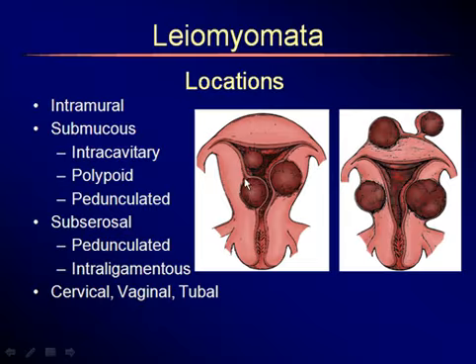In this case, we should say that this is a fibroid which is over 50% submucosal, and the rest of it is intramural. And then if you tell the clinician there's a centimeter or 1.3 centimeter myometrial covering, then they know precisely they can go in hysteroscopically and take this out.